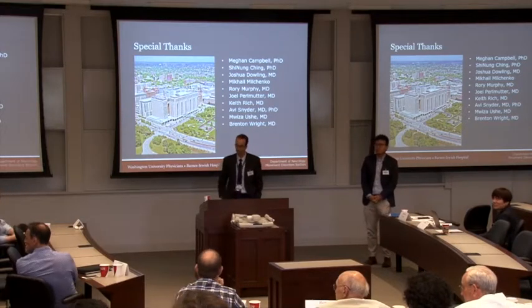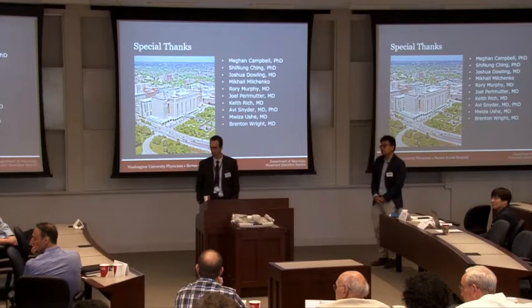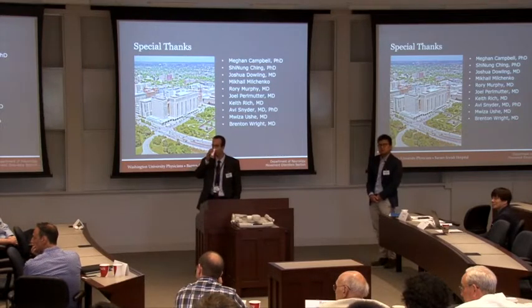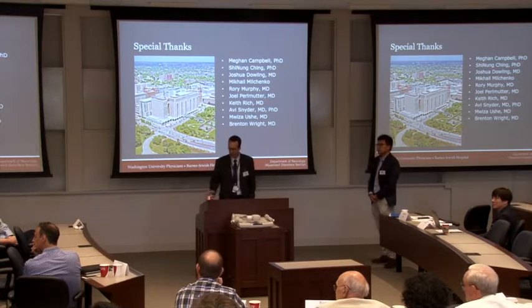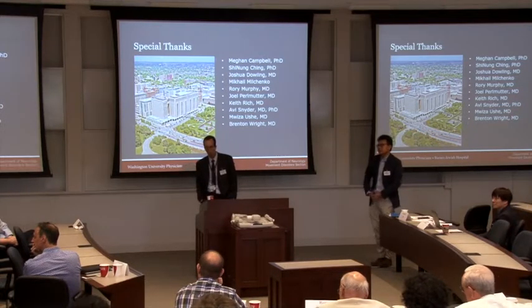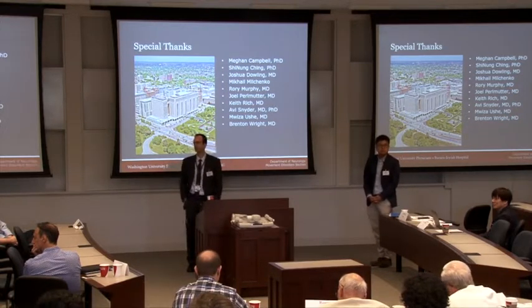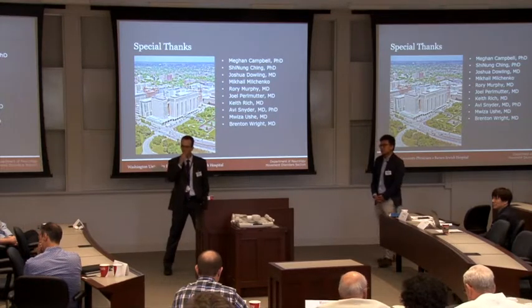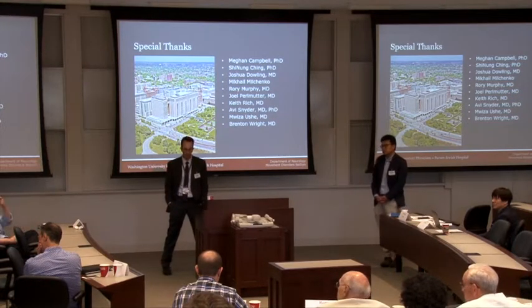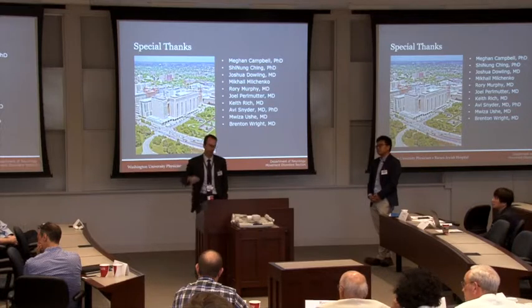That was great. I think this audience might really appreciate some discussion about how you have lots of knobs to turn once the device is implanted. I know a little bit about this through some exposure to clinical Parkinson's. I'm curious about your thoughts on having too many knobs. Also, as I understand it, some of the knobs you turn change some parameters for DBS, and the effects of that don't occur immediately, but could be a week later or something like that.